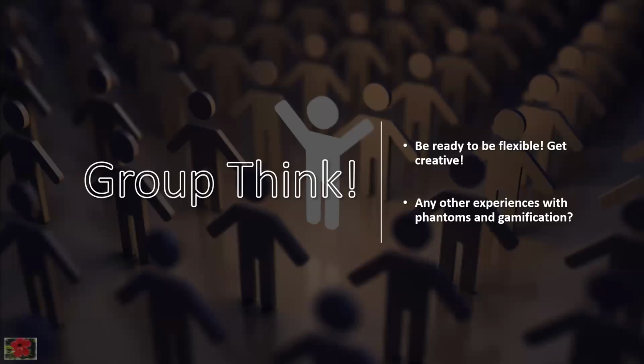So be ready to be flexible, get creative, look around in your home for objects that you can use to build your task trainers before buying the supplies. And for gamification, our workshops have headed towards competitions between fellows and attendings as learners on doing the procedures. It might come naturally, as we're competitive in the medical field. The reward system would be who gets the procedure done faster and gets scored, and cheerleading for that person makes it part of fun learning as well.